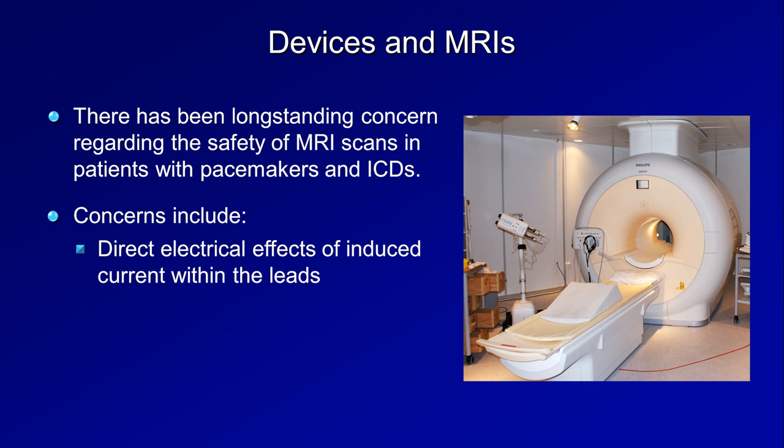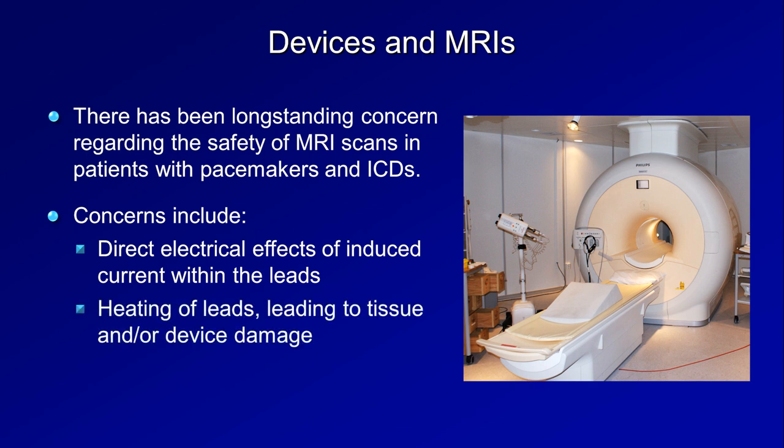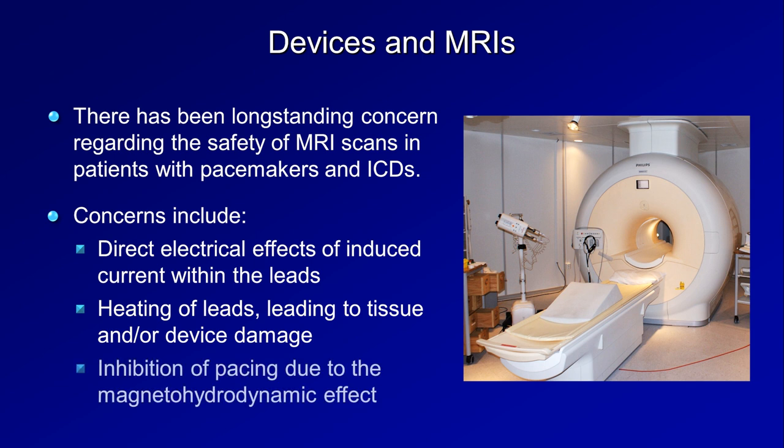But these are not the only concern. There's also the possibility that the induced electric current will heat the leads, leading to tissue and/or device damage. There's also the theoretical possibility of pacing being inhibited during the scan due to something called the magnetohydrodynamic effect, which can create a voltage across the lumen of the descending aorta due to ions in blood moving through a strong magnetic field. These voltages could be misinterpreted by the pacemaker as intrinsic cardiac electrical activity inhibiting pacing.